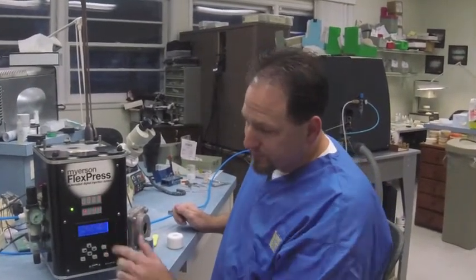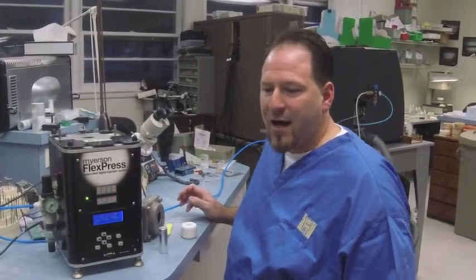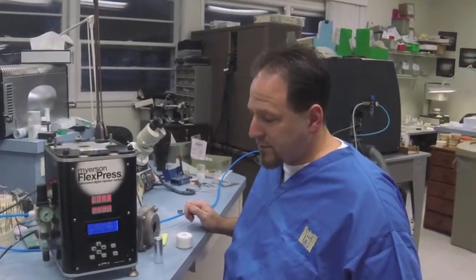The machine's up to top temperature and it's beeping at us. If you're working on a case that's not quite ready yet — still a little hot or you're drying it out — and this is annoying, you can always hit the arrow down button and everything stays the same. It's still ready to go, it just keeps it quiet so it's not so annoying.